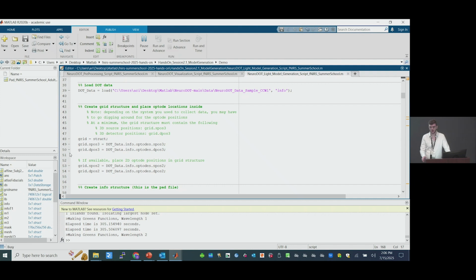That's a great question. You would probably need to hardwire your own code for that. I've built a pipeline for a collaborator that has done similar things. So if you wanted to work with us on that, or do it yourself, that is 100% possible and doable. Yeah, that sounds great. Thank you. Awesome.